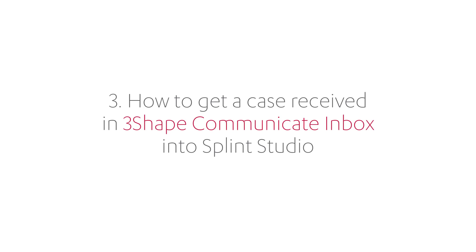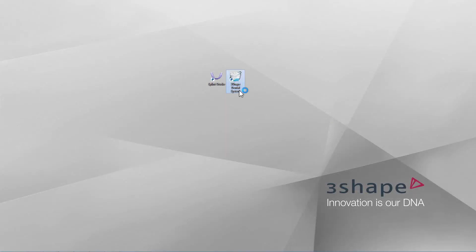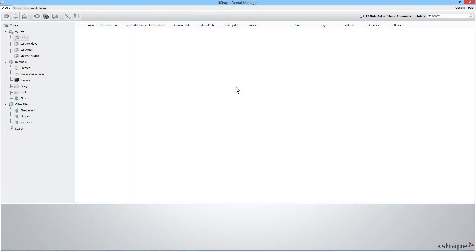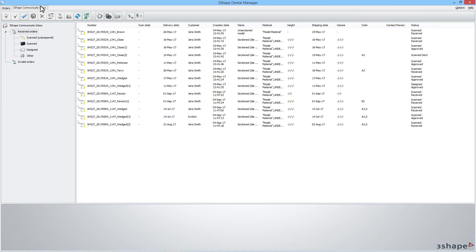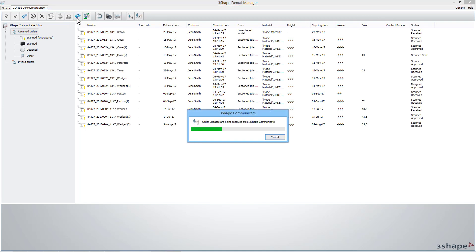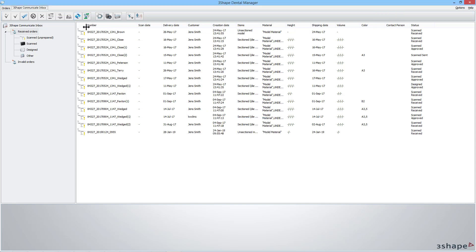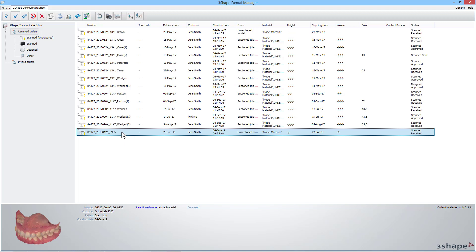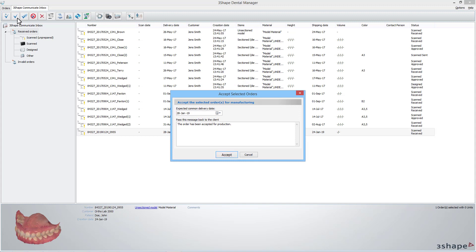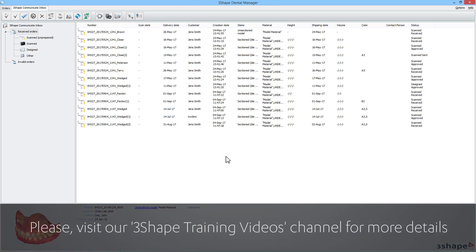Now we will look at how to design a case received in the 3Shape Communicate Inbox in Splint Studio. Open Dental System and go to the 3Shape Communicate Inbox tab. If you don't see any new cases, click Refresh. Select a case from the list and accept it. To learn more about 3Shape Communicate and Inbox, see the 3Shape Communicate playlist on our YouTube channel.